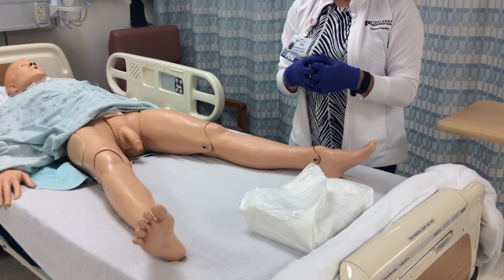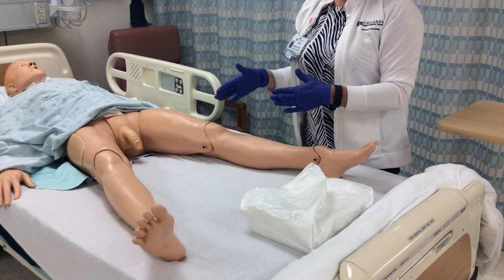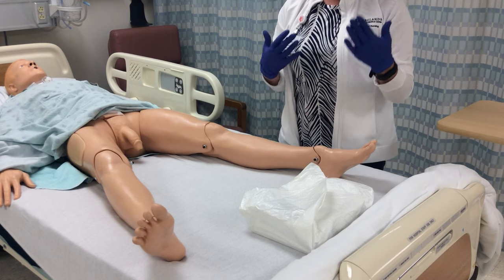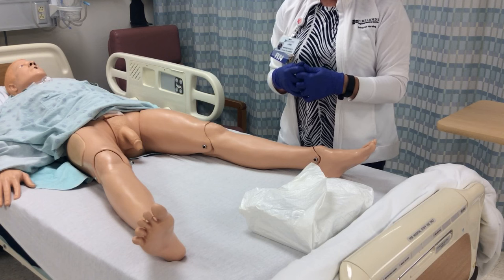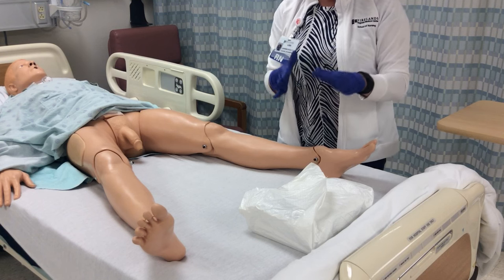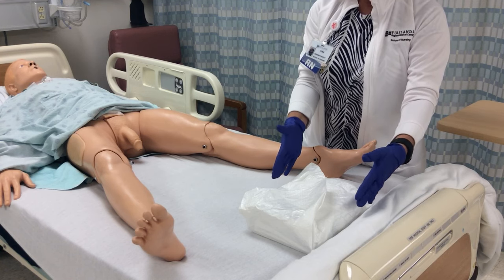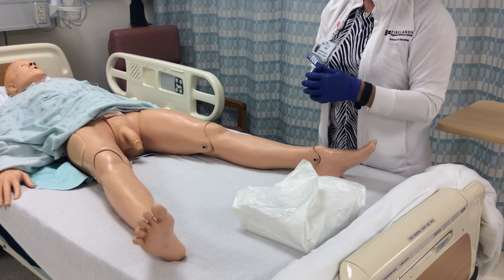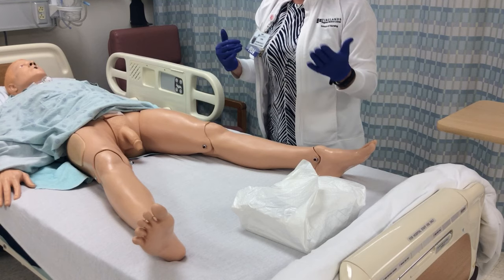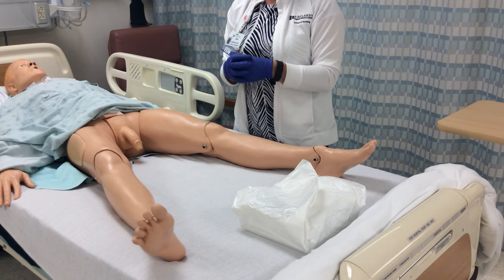This video is part two of the Foley catheter insertion and will cover the catheter insertion on a male patient. Continue to follow the steps from the very beginning of the Foley catheter insertion on the female patient; this video will focus on the differences between the male and female catheter insertion.